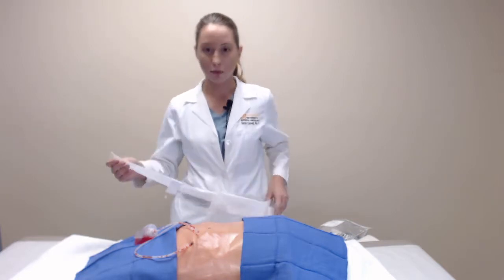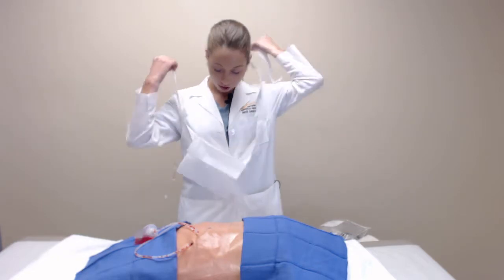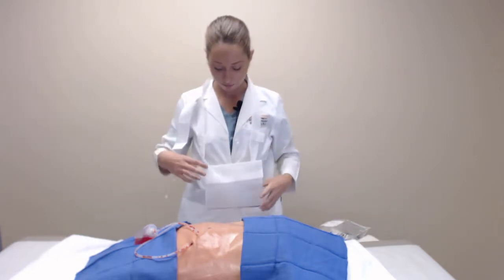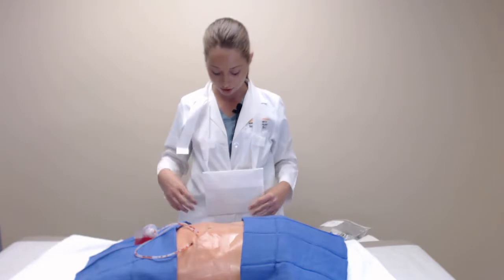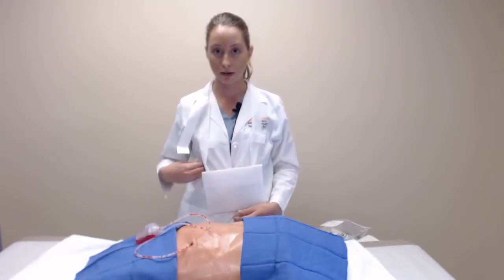If you are uncomfortable wearing it around your waist, you can wear it as a necklace, and you can secure it using the same method that you would as a waist belt. However, something that's important to keep in mind is that if you're going to wear your drain belt as a necklace, your bulb has to be located lower than where it comes out of your skin.